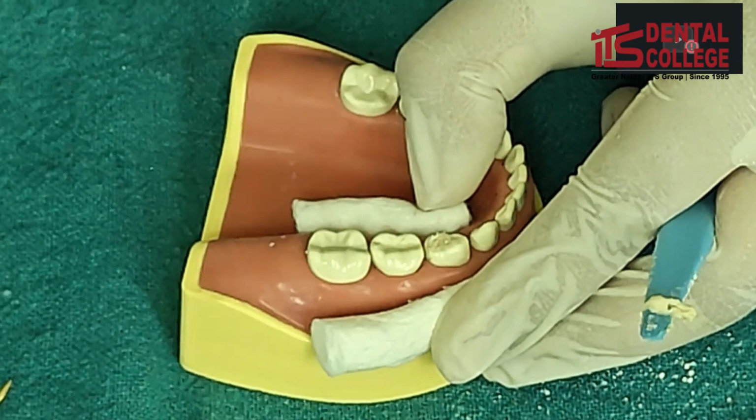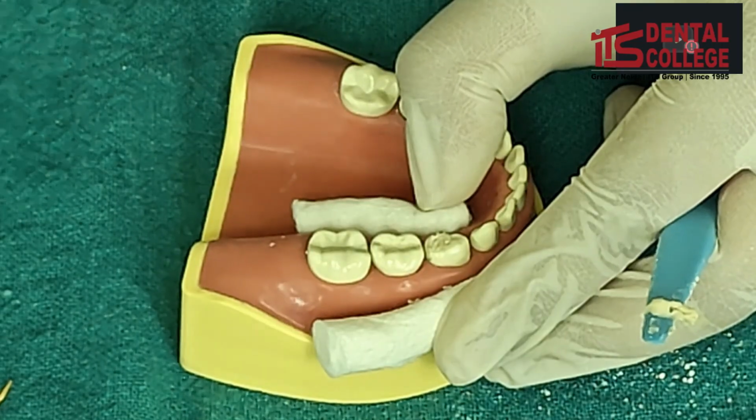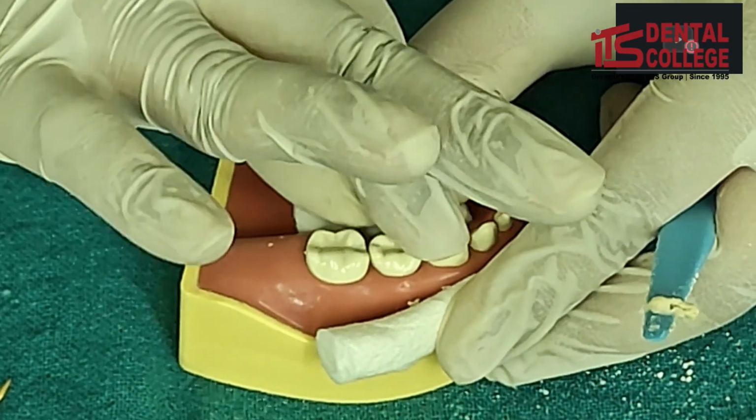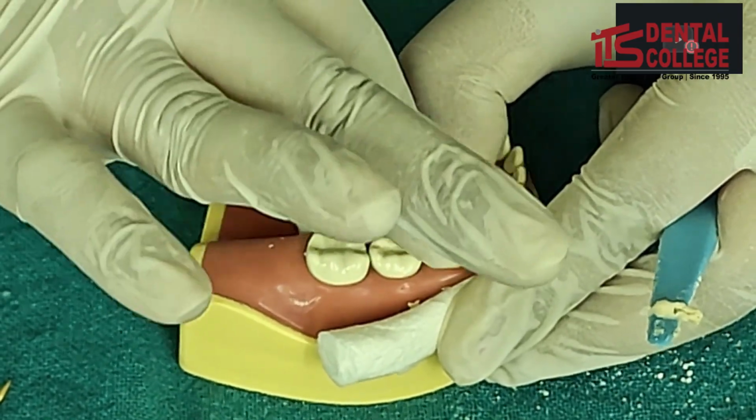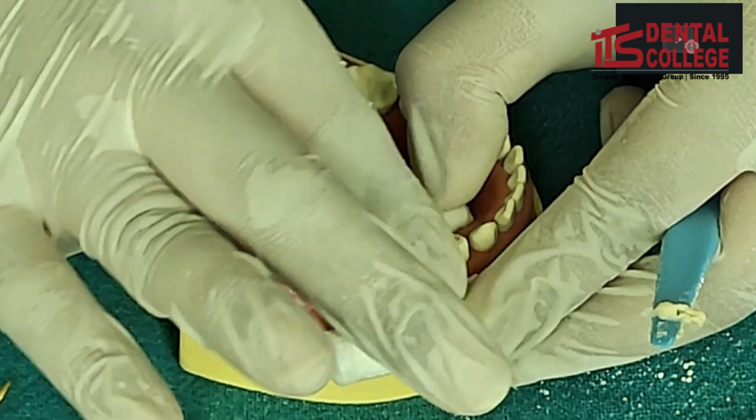Coat Vaseline on your forefinger and apply pressure onto the GIC. This way, it firmly secures into all the confines of the cavity walls.